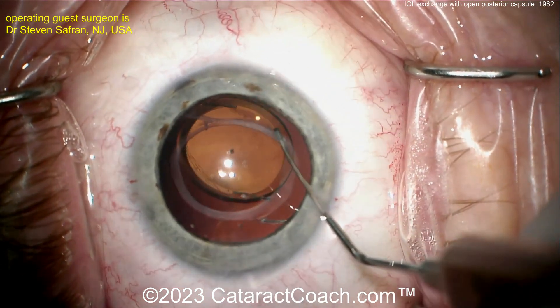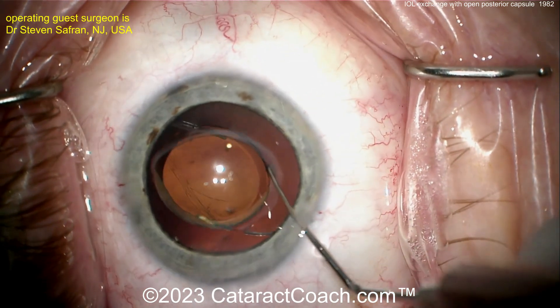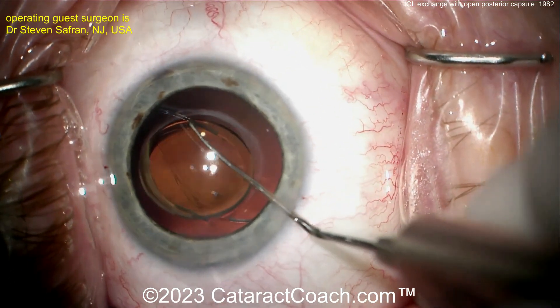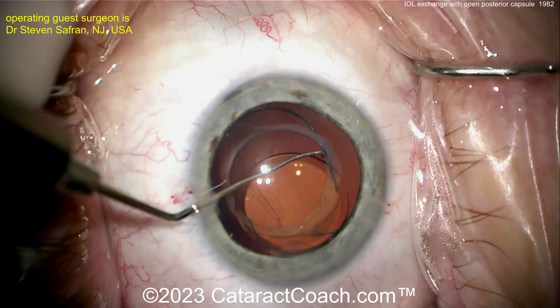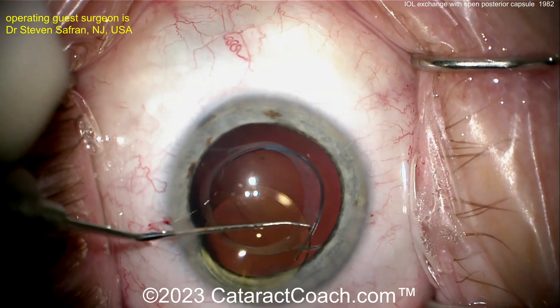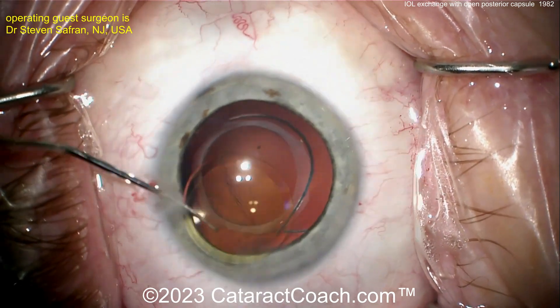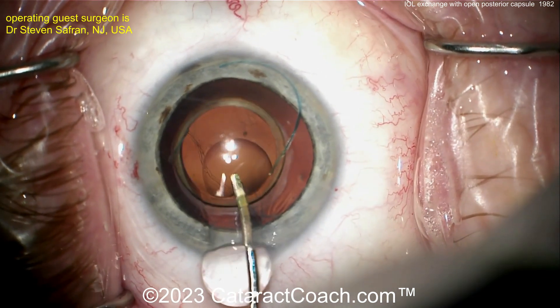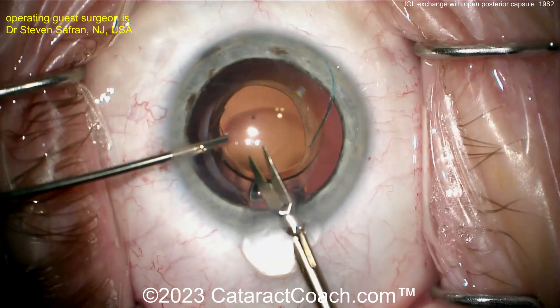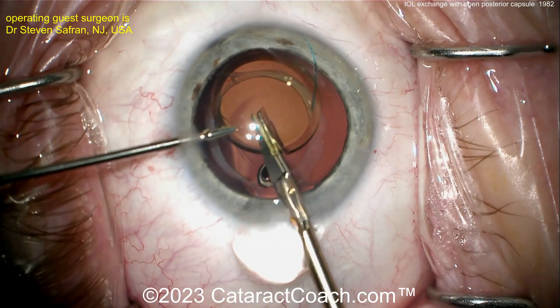With one haptic amputated, it's much easier to maneuver the lens and get the optic above the capsule, through the capsulorhexis. Now the other haptic can be pulled out of its fibrotic tunnel. At this point, one haptic and the optic are above the capsule in the anterior chamber — and now the lens can be expanded for removal.